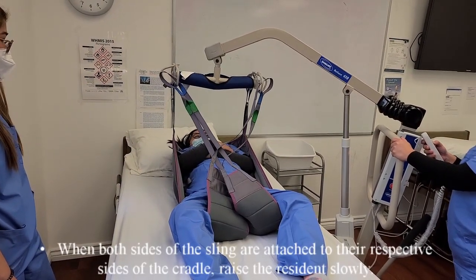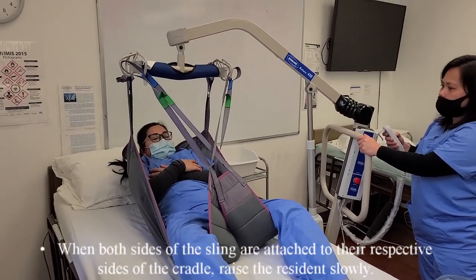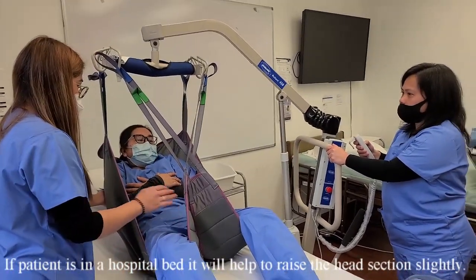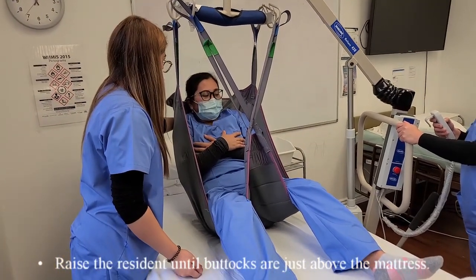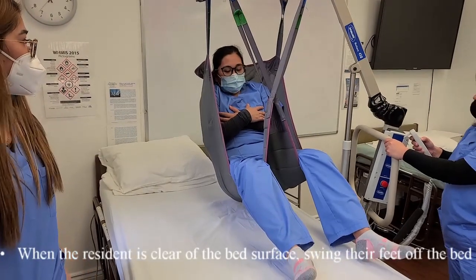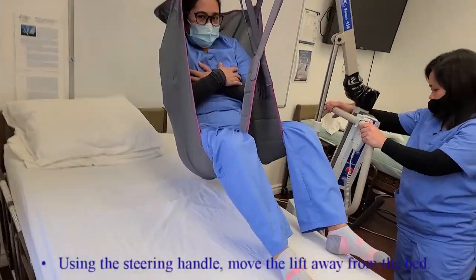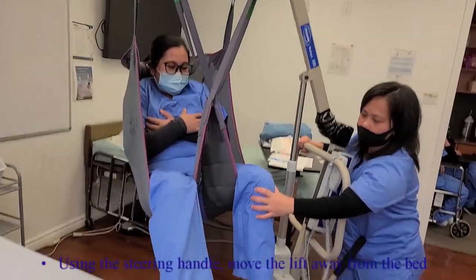When both sides of the sling are attached to their respective sides of the cradle, raise the resident slowly. If the patient is in a hospital bed, it will help to raise the head section slightly. Raise the resident until buttocks are just above the mattress. When the resident is clear of the bed surface, swing their feet off the bed. Using the steering handle, move the lift away from the bed.